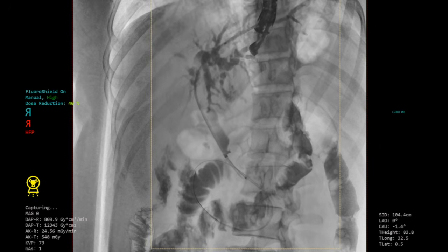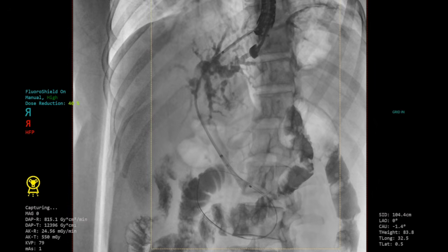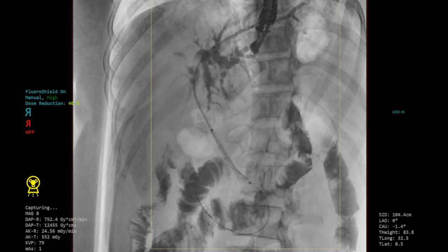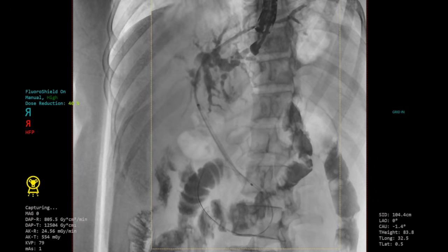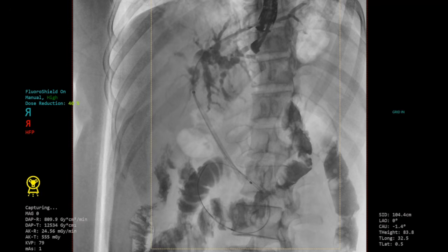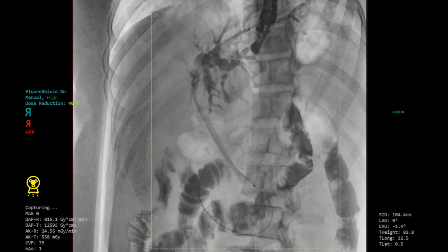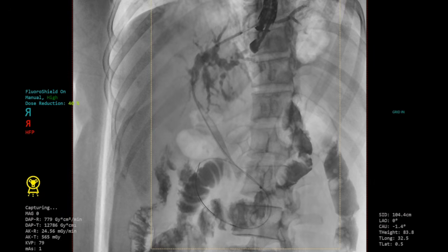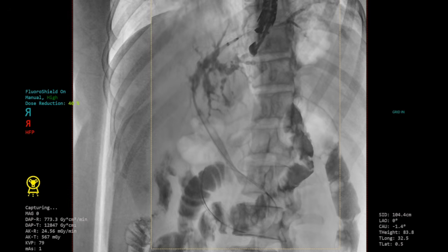The endoprosthesis should be advanced gently in the plane of the guide wire into the liver. If resistance is encountered, it oftentimes means that the plane of access is dislodged and therefore requires reorientation. The endoprosthesis is then deployed, traversing the stricture. The guide wire should not be removed immediately because it may facilitate the placement of a second stent should there be any misdeployment of the first stent.